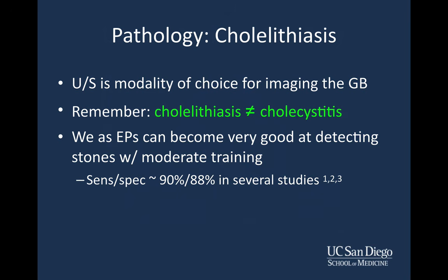Now, when we talk about cholelithiasis, just remember that ultrasound is a modality of choice for imaging the gallbladder, but also remember that cholelithiasis does not equal cholecystitis. Just because one has stones doesn't mean stones are the cause of your patient's symptoms. There's plenty of literature to demonstrate that we as emergency physicians can become very good at detecting stones with a moderate amount of training, certainly a lot less than you're likely to receive in your residency training.